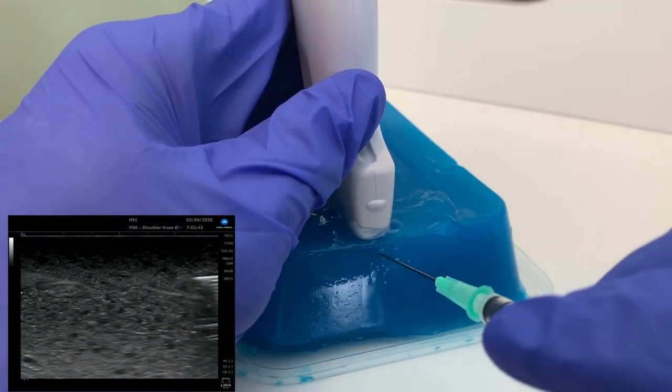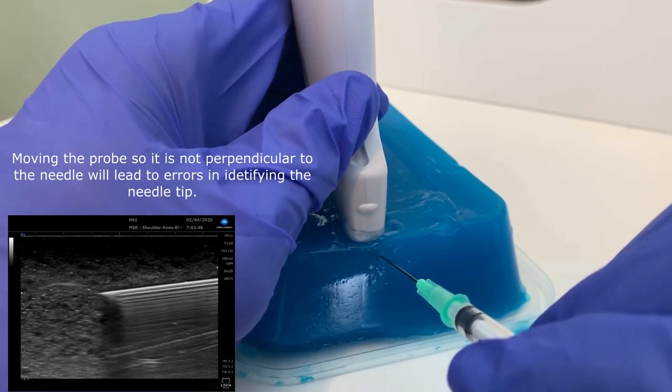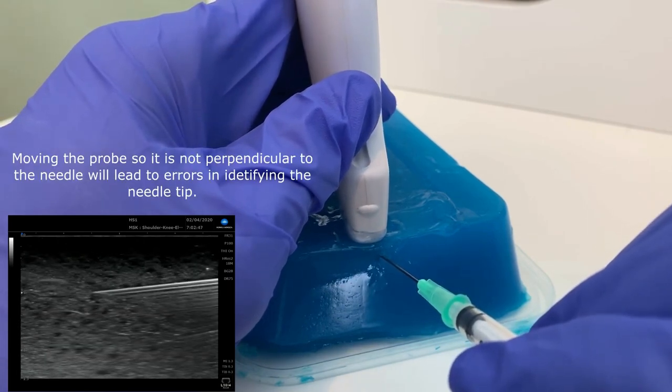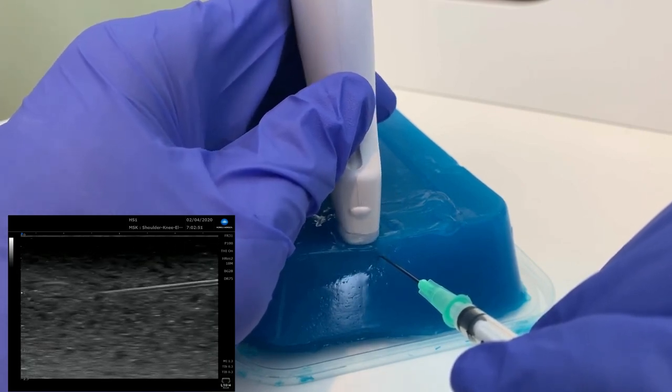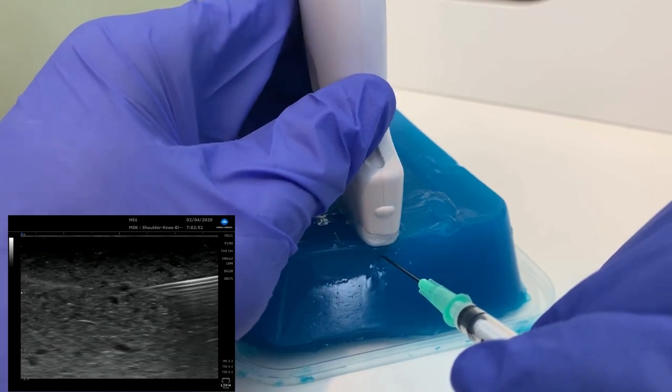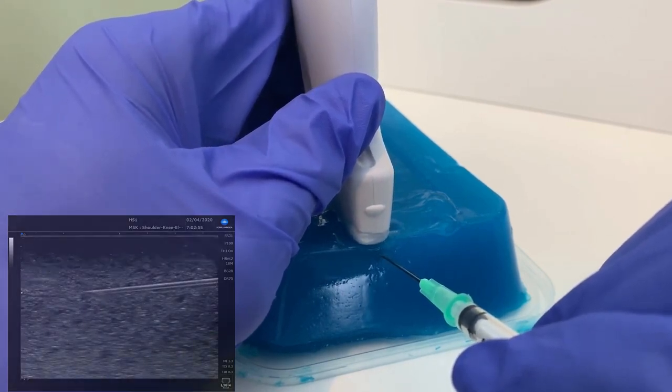In this live demonstration, you can see the needle tip here very clearly with lots of reverberation artefact. If I then move my probe oblique to the needle shaft, you'll see that it shortens the needle appearance like that — and that is what is called crosscut artefact.